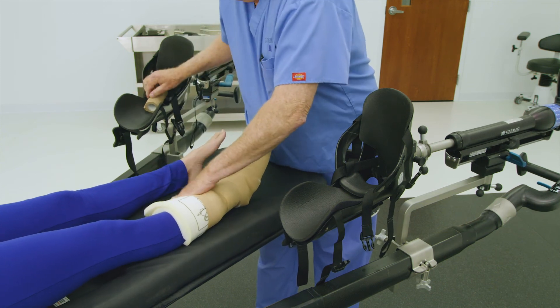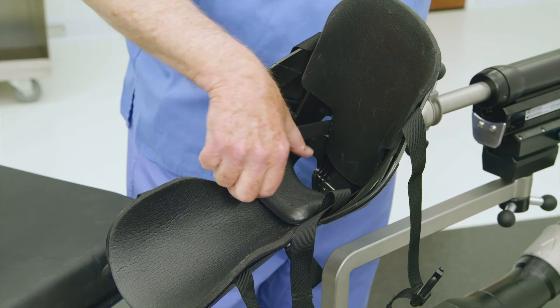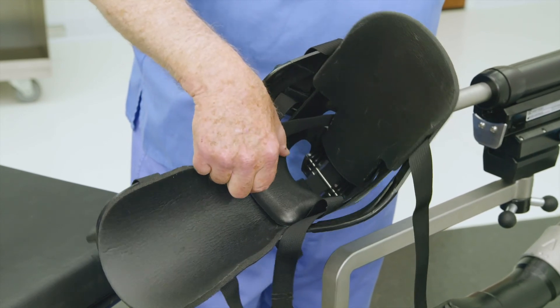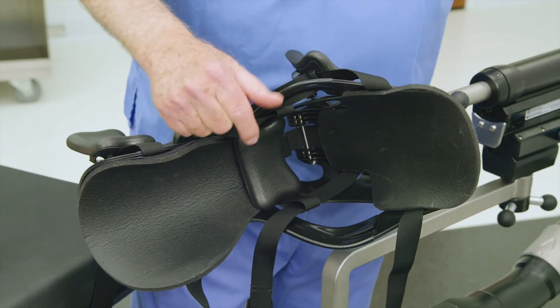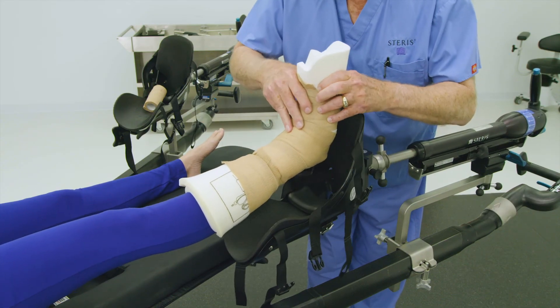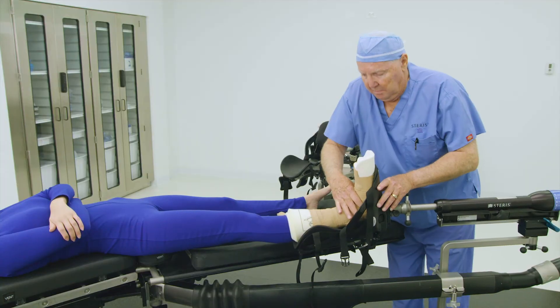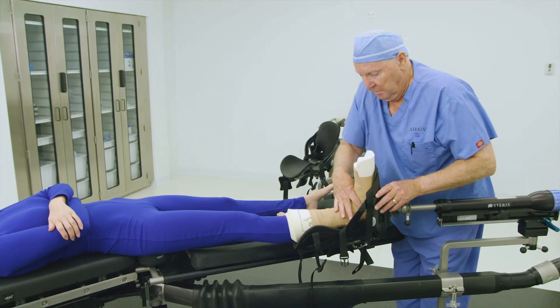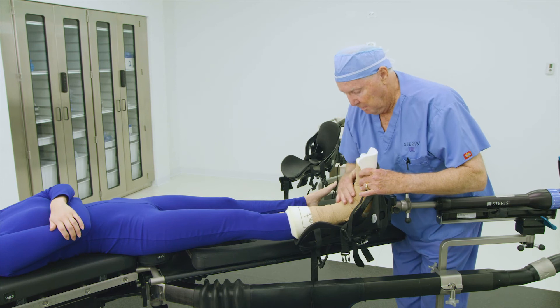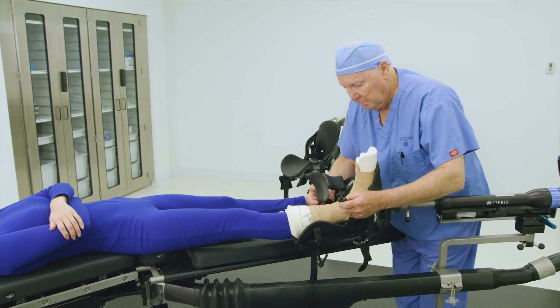Once the foot is prepped with padding, ensure that the floating Achilles tendon pad is positioned appropriately as shown here and is not stuffed down into the heel area. Place the patient's foot into the boot so that the heel rests against the bottom footplate and the foam padding is as close to the patient's calf as possible. Ensure the Achilles pad is positioned against the Achilles tendon.